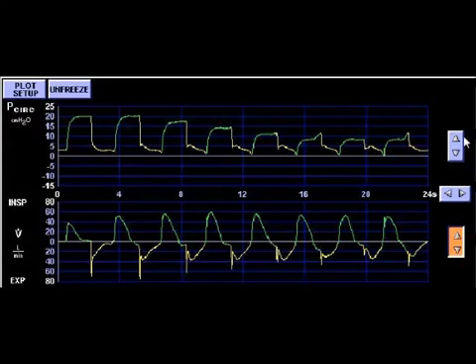What we're going to do is look at my pressure waveform and at my flow waveform here. So we're going to see a couple things. This patient has a high inspiratory drive. What the ventilator always wants to do is target the tidal volume you have set. So if the patient has a vigorous inspiratory drive, it's going to measure the tidal volume, and then it's always going to look at my expiratory tidal volume. As you can see happening here, the ventilator is kind of thinking, and every breath it's decreasing my pressure. So here's my pressure setting.